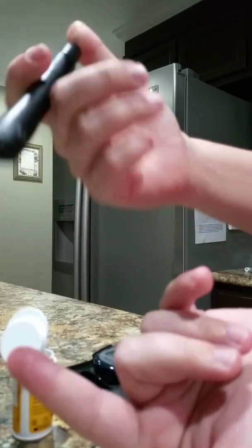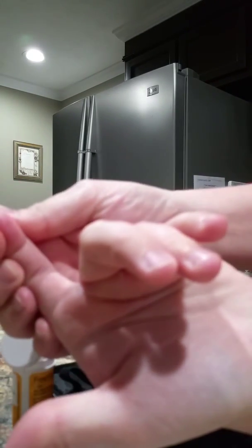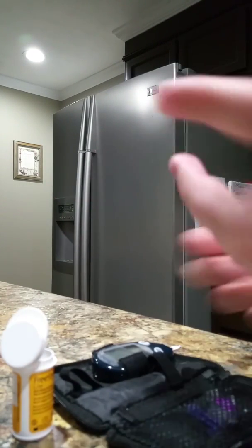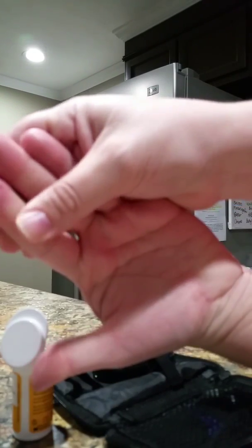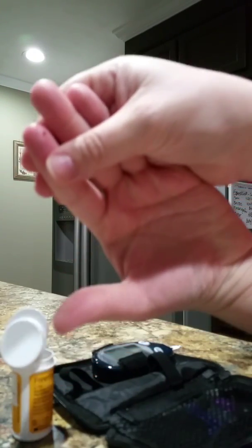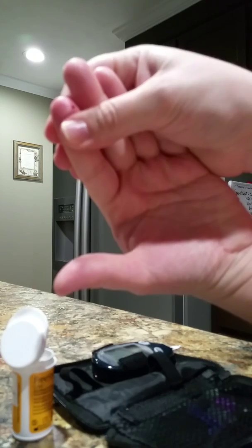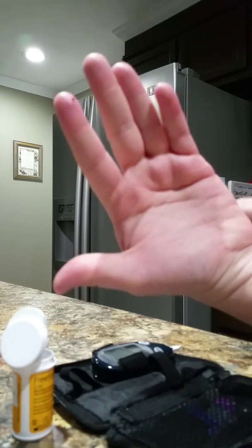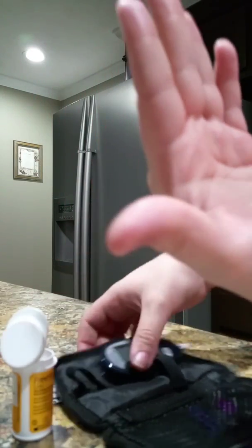Then you push the top of this down. I barely felt it. It did not hurt at all. But you can see there's the blood. Now, if enough blood doesn't come out, you squeeze your finger, which I hope you can see like this, until it does. You don't need very much blood. You only need a little bit.